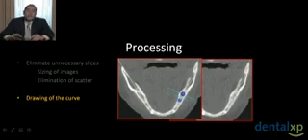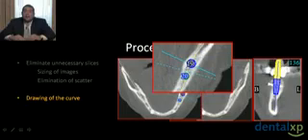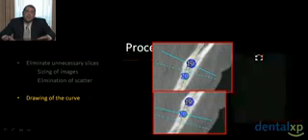So when we look at this, let's call it tortuous curve that's been drawn, the impact of this is that this implant that's placed in that cross-sectional image is placed in the orientation of the curve, or perpendicular to the curve that's been drawn. And so let's look at implant number 19. We see the blue line, right? That's the orientation of the cross-sectional image where this implant number 19 is being placed. And now let's look at cross-sectional image number 20. And we see that the cross-sectional image for number 20 and the cross-sectional image number 19 almost converge on each other. Well, here's what happens.